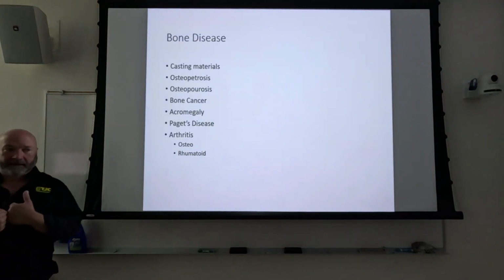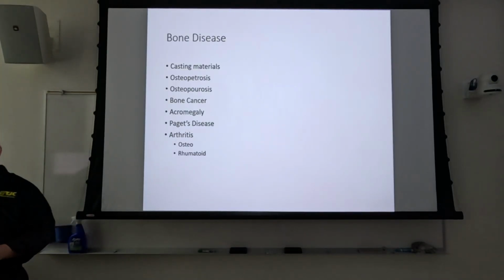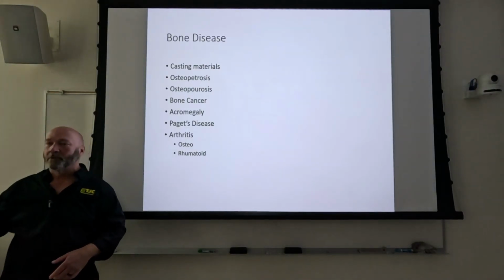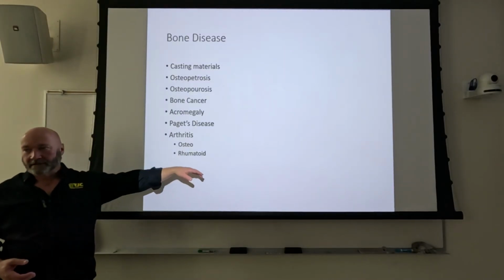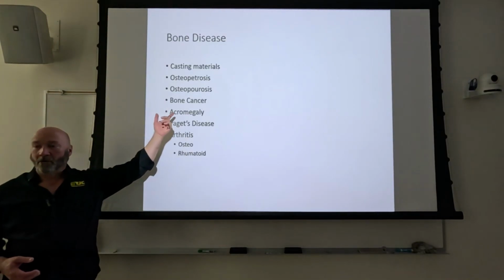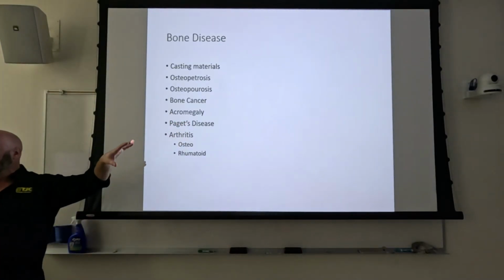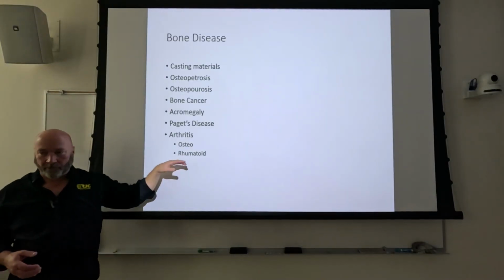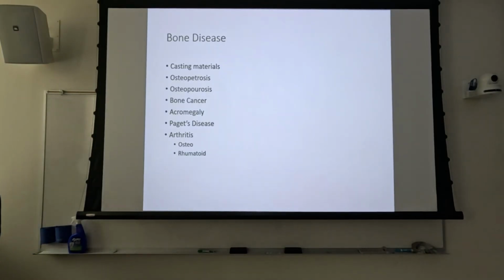Because of that constant irritation, bone on bone, those articular surfaces will be brighter, but you don't really have to change technique. Rheumatoid arthritis looks like osteoporosis, only worse, right? With osteoporosis, all the bone is there. It's just that the cortex is smaller, as opposed to rheumatoid arthritis. Those articular ends will just start to deteriorate.